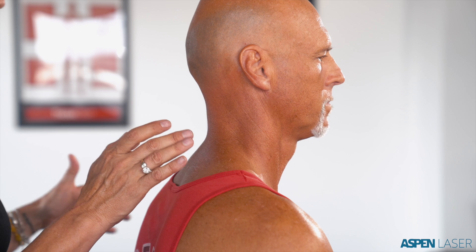At this point I'm going to select my settings. The way to select proper settings is based on the depth of the target. My client is an average size male. My setting would be different for a small senior person with less muscle mass, or a very large or overweight client. In this case, my depth of penetration in the trapezius or neck muscle he pointed to is going to be approximately three to four centimeters deep. I select the protocol button on my unit, choose the setting that says three to four centimeters, and press the start button to arm the laser.